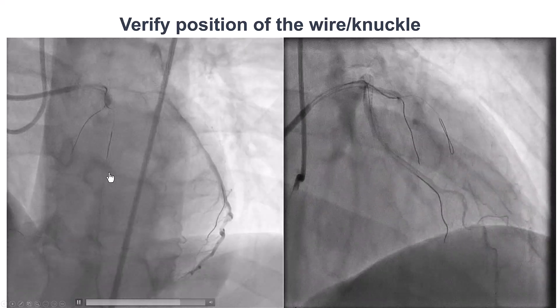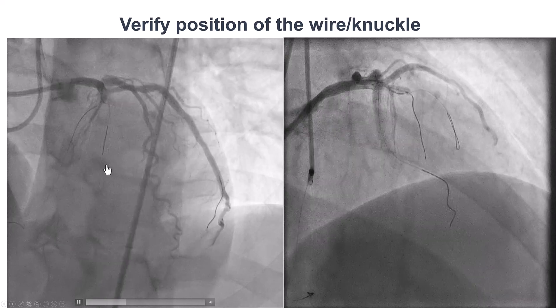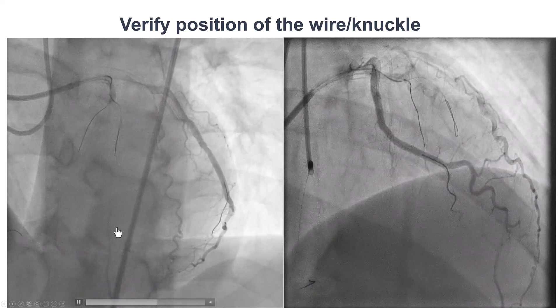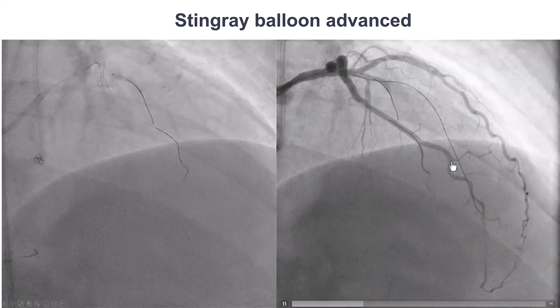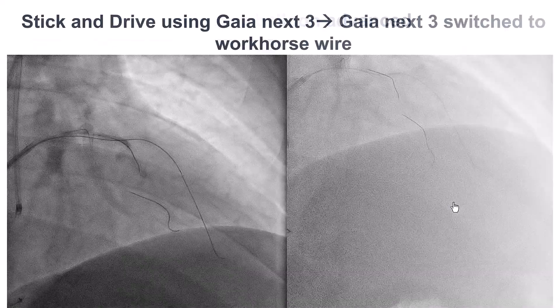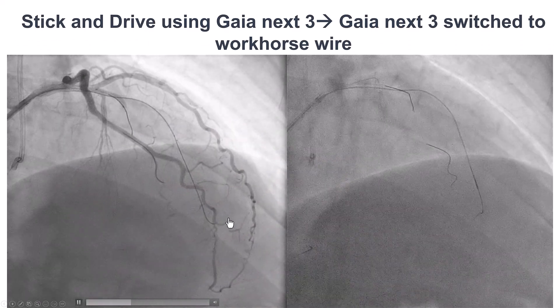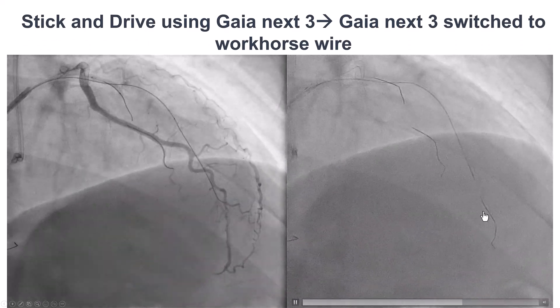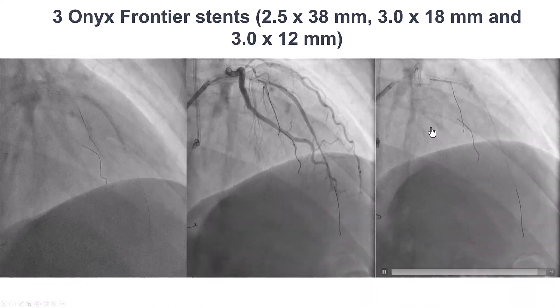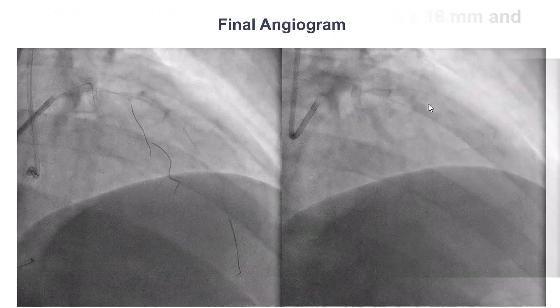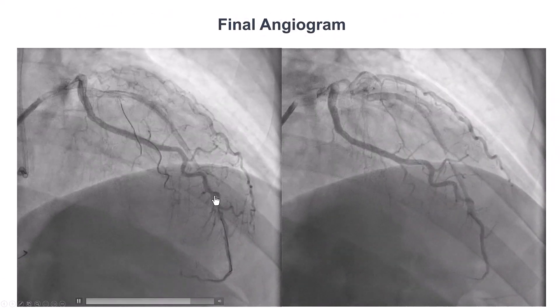This was verified by contralateral injection. In contrast to the previous injection, we now have dancing of the antegrade guide wire along with the vessel. We then advanced a Stingray balloon to the area of re-entry and performed the stick-and-drive technique using a Gaia Next 3, which advanced into the distal true lumen. This was exchanged for a workhorse wire, the vessel was pre-dilated, and three drug-eluting stents were placed, providing a nice result with TIMI-3 flow down the LAD.